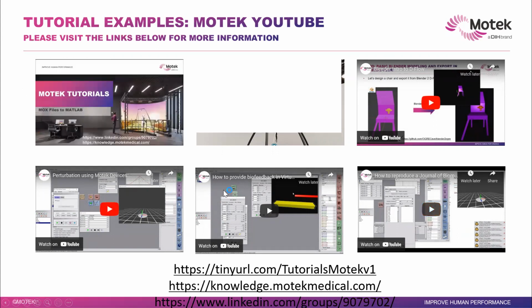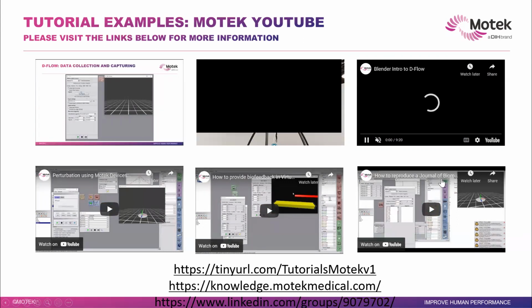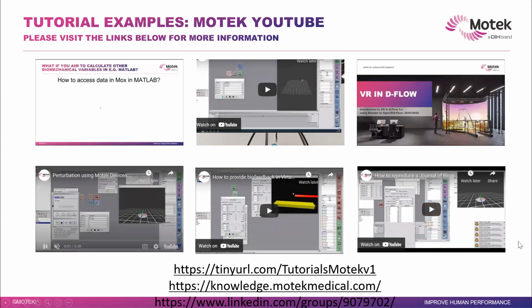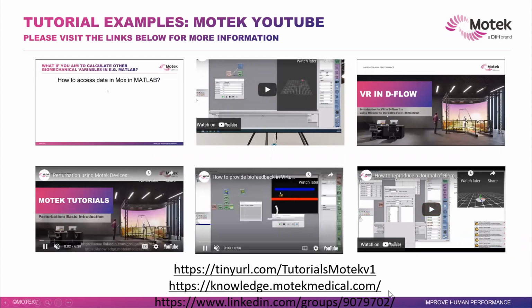Also perturbation types of things, feedback or biofeedback, or even if you find a journal paper that you want to reproduce, how you can do it quite quickly in D-Flow. So there are quite many possibilities.